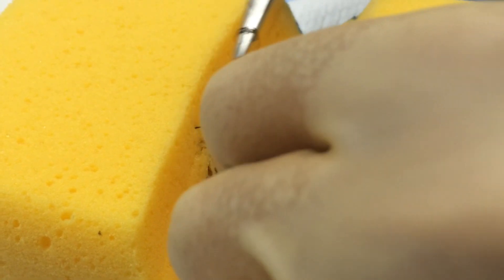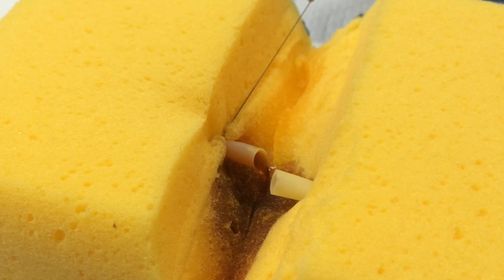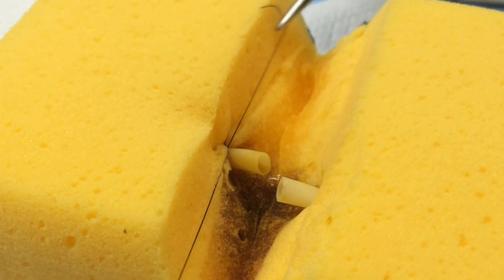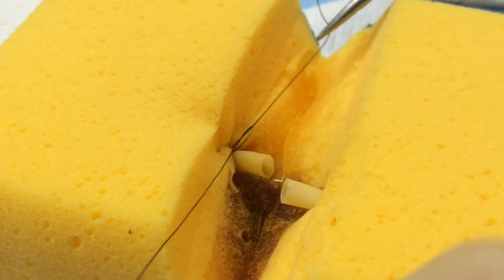If you could clearly see the end of the blood vessel, a better technique would be to clamp it off and simply ligate it as shown in a previous video. In this demonstration I'm using nylon suture for clarity of demonstration purposes, but in a real situation you'd more likely be using an absorbable suture such as vicryl.